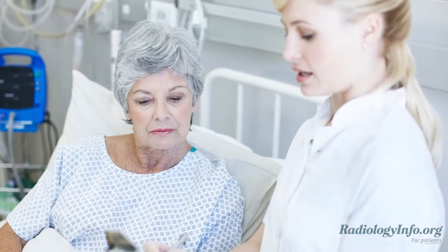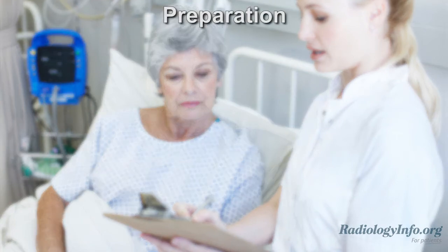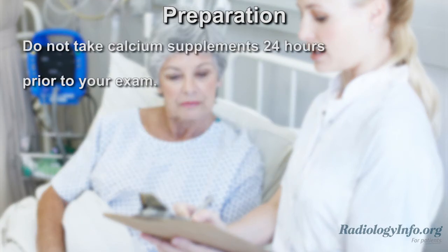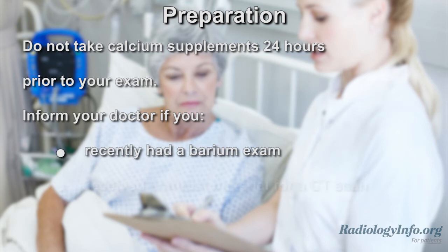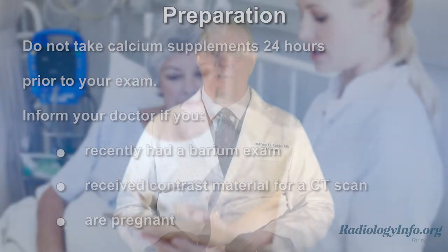If your doctor has scheduled you for a DEXA scan, there are several things you can do to prepare. First, you should not take calcium supplements for at least 24 hours before your exam. Tell your doctor if you recently had a barium exam or if you received contrast material for a CT scan. Also, be sure to inform your doctor or technologist if there is any possibility that you might be pregnant. For the exam, it's best to leave jewelry at home and wear loose comfortable clothing without metal buttons or zippers. You may be asked to wear a gown.